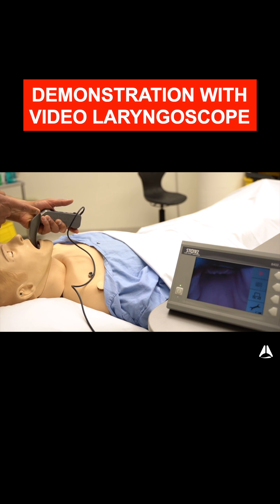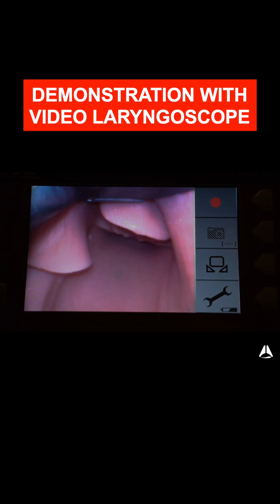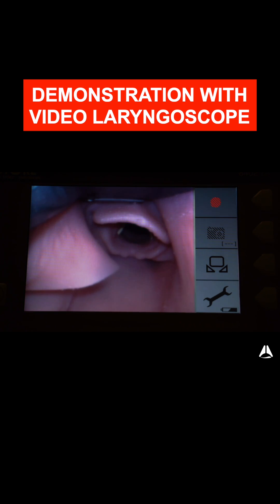Imagine right now that my laryngoscope blade is directly back. At this point I then use the tongue — the tongue is the road down to the vallecula. So I follow the tongue all the way down to the vallecula.